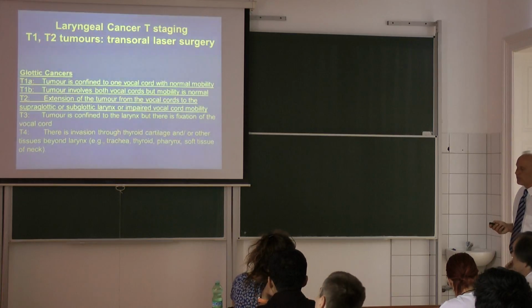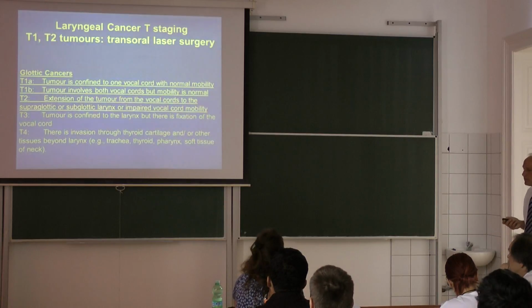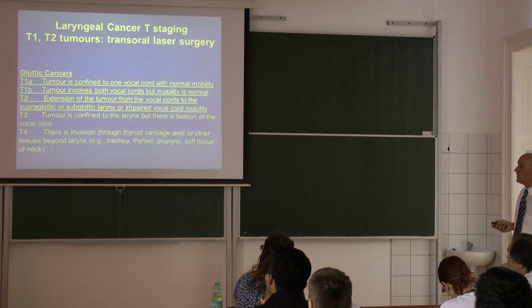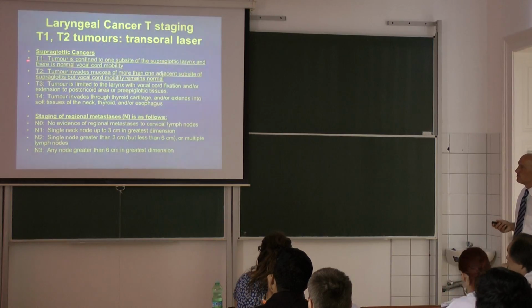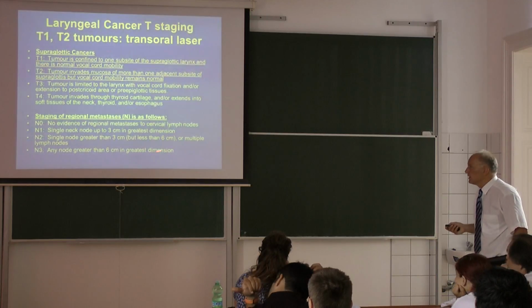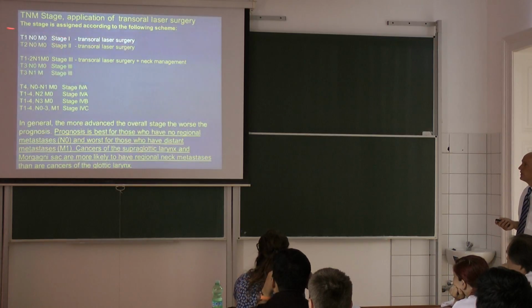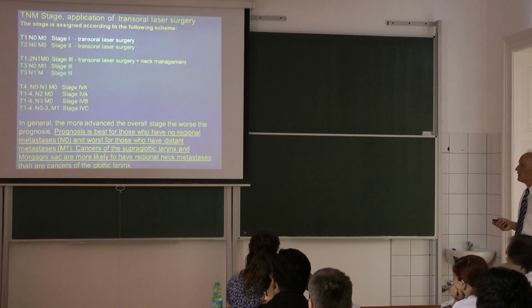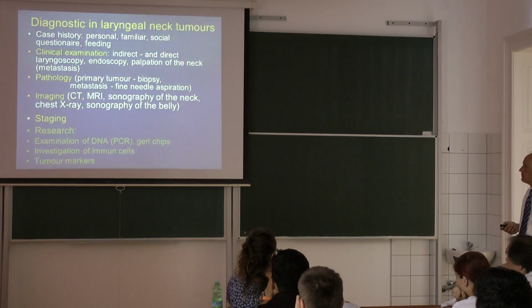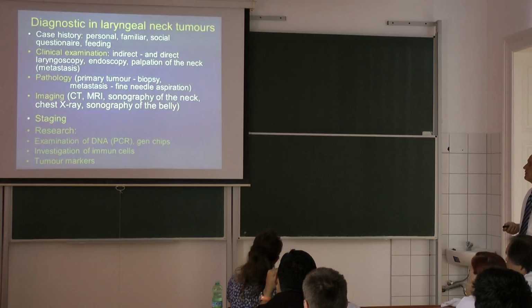For laser treatment, we usually apply this laser system for small glottic and supraglottic tumors, meaning T1 and T2 from the TNM classification, and in the stage classification, stage 1, 2, and the initial part of stage 3. These are the tumors applicable for laser resection.